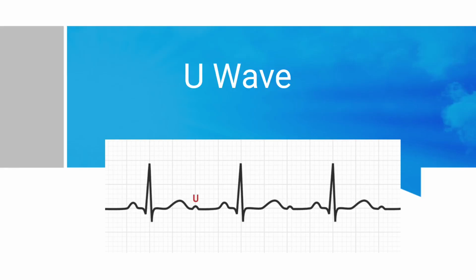Hi friends, in this series of ECG Basics, today I will talk about U waves.